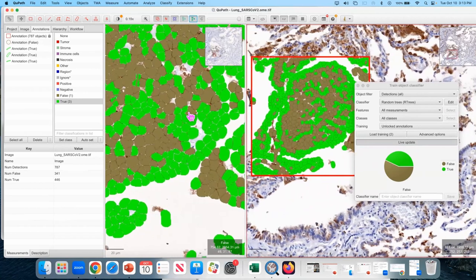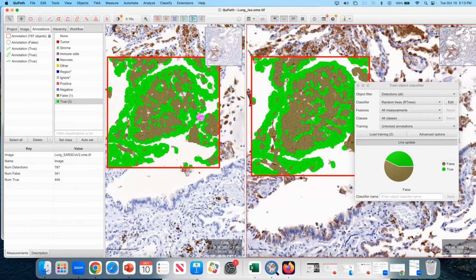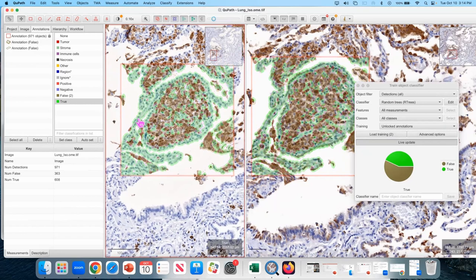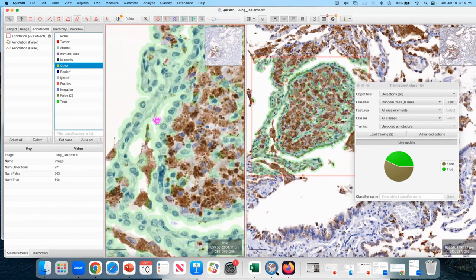So what I like about this example is that it shows you that there is potential in this classifier, but it still got things wrong, okay? On this image, it kind of looks like it did the right thing, but in this image, we immediately see that we kind of need another class, of cells that don't have anything. We could also try to limit the features that go into that classifier and only, for example, look for the DAB cells. But I'm gonna go through the route of adding a class of cells that are negative, or maybe I'm gonna call them other. Because positive and negative, they're a little special classes.